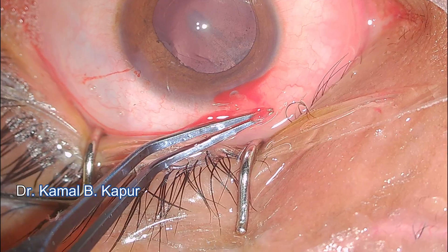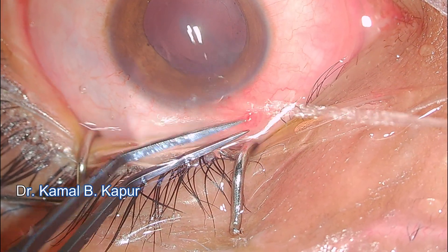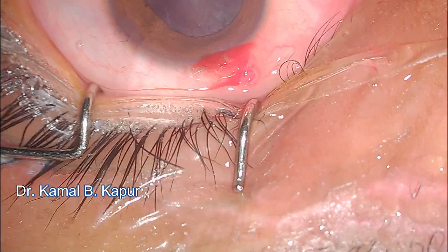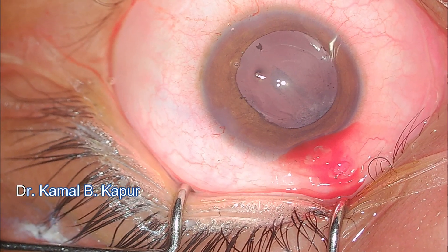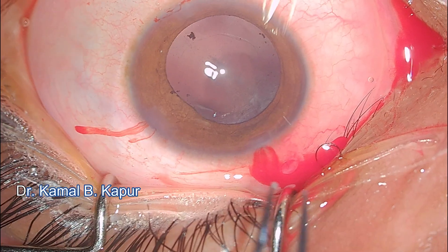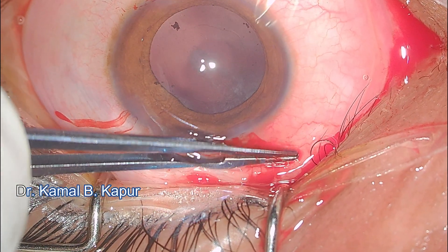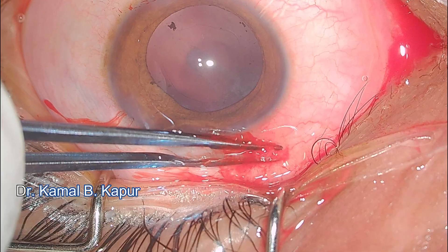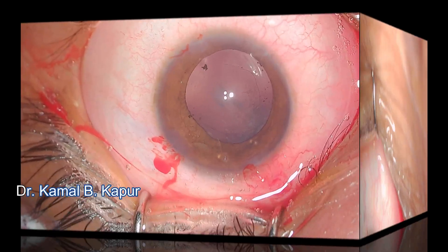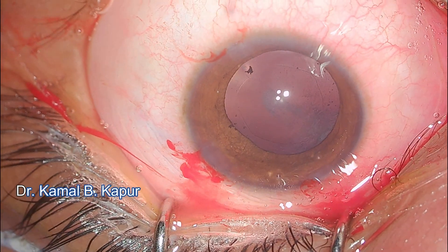The patient has no complaints about the glass particle. It is a sterile cyst with a very small glass piece. I check whether cutting open this part of the conjunctiva reveals any protrusion into the intraocular area. I decide to insert the IOL first and then reassess. I realize the piece is now freely mobile and totally visible — it is only a subconjunctival impacted glass particle.